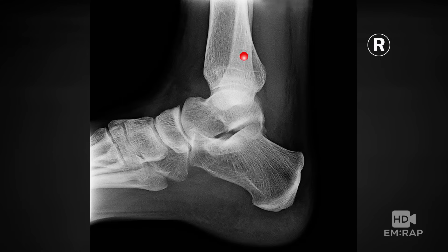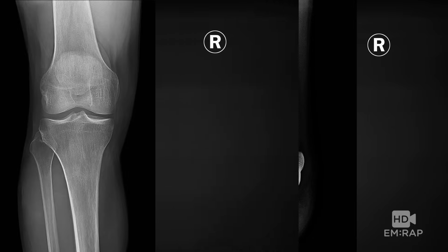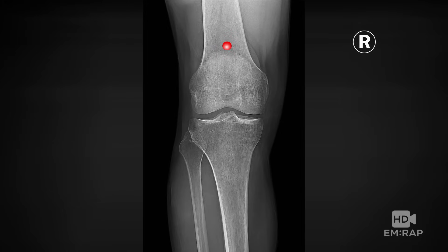Here are some other options for placement. You can go in the distal tibia as well — basically it's like the medial ankle where the medial malleolus meets the shaft of the tibia. Another option is the distal femur, and for that you would go two finger breaths above those wide condyles of the knee, right smack in the middle.